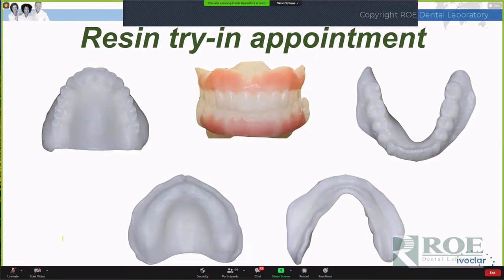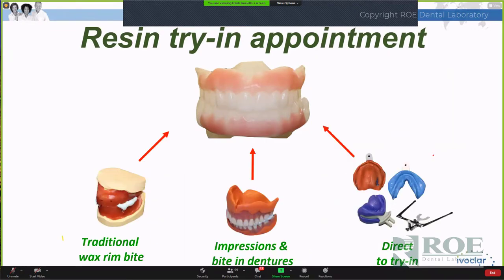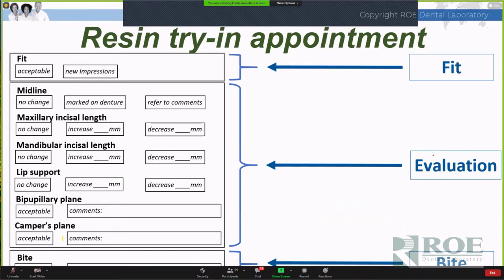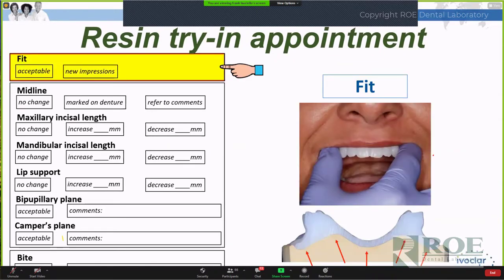But again, it's a monolithic try-in, and all roads lead to the same try-in. Whether it's the wax rim bite, the impressions in the denture, a copy denture, or the directed try-in, they all lead to the same thing, and that's going to be the monolithic resin try-in procedure. So again, we're going to use our same criteria here, and we're going to look at the try-in in three phases, basically. The patient presents, we try them in, and you test for fit.